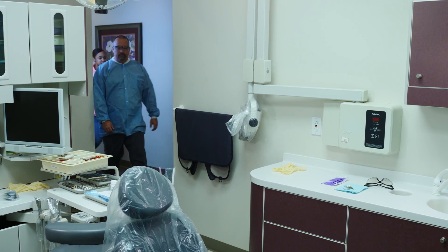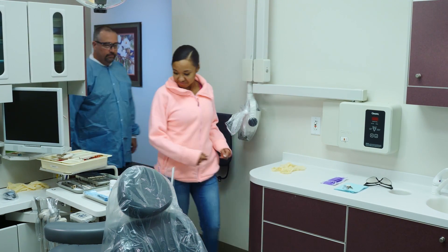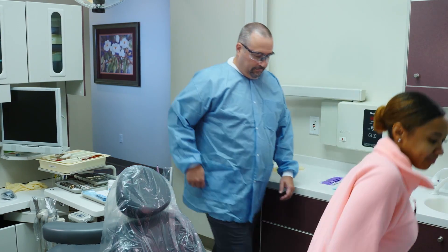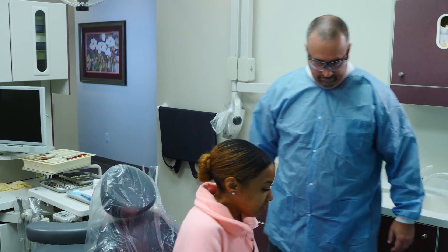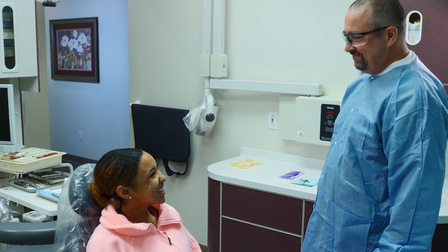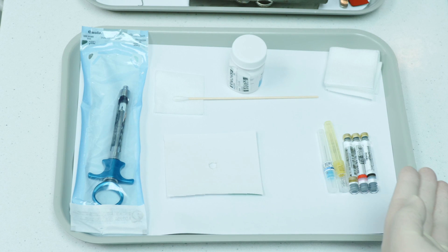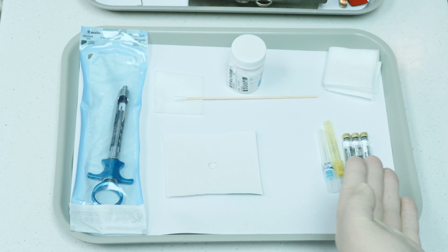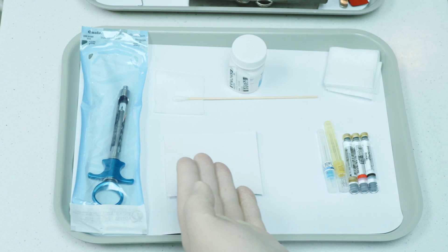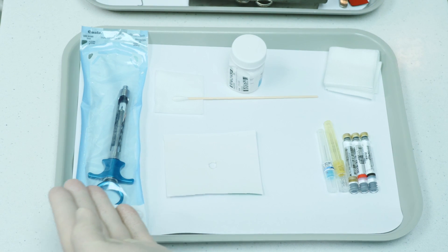Local anesthetic procedures are used as a component of other procedures. Therefore, the room, all equipment, and the patient should be set up already for that procedure. Ensure that all necessary items for the application of anesthesia have been included in this setup.